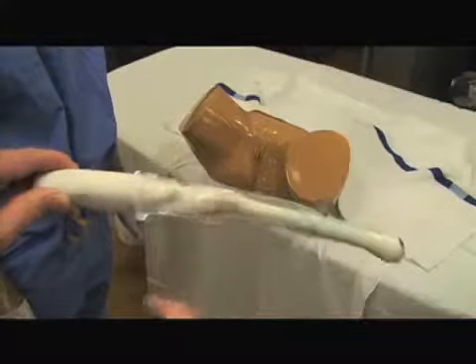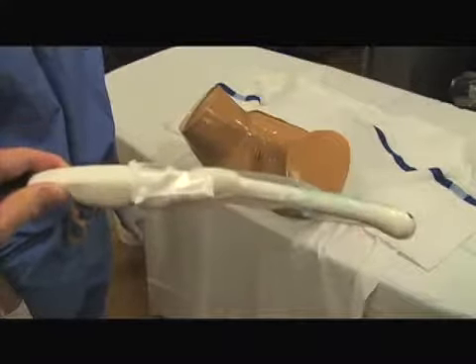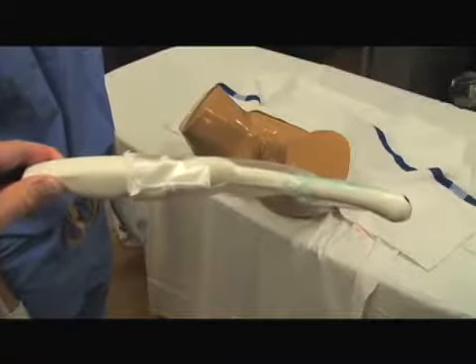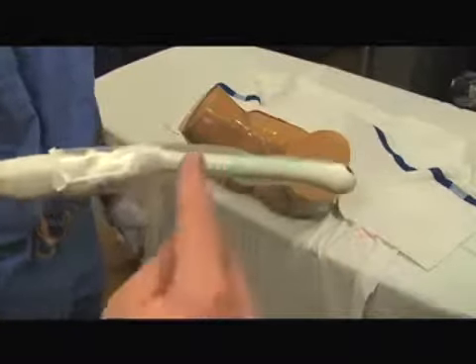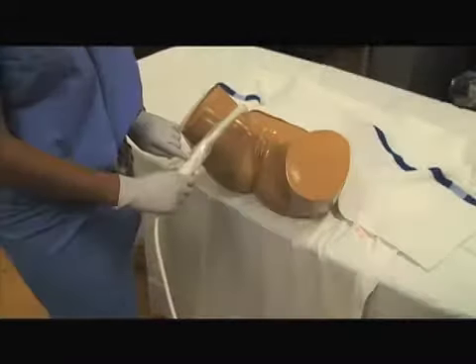I'm pointing here to the notch in the top of the probe that is the indicator or marker dot on the probe, and that'll match us to the indicator dot on the ultrasound screen. Notice we also have a sheath on the probe, and that's standard for GYN sonography. Remember that the probe must be thoroughly cleaned in between different patients as well.